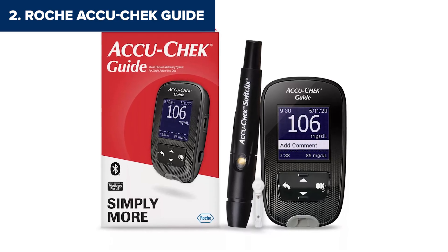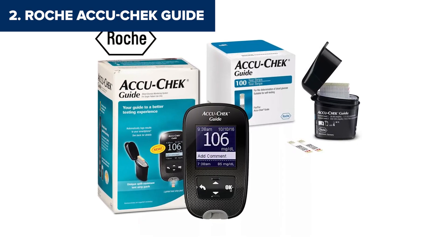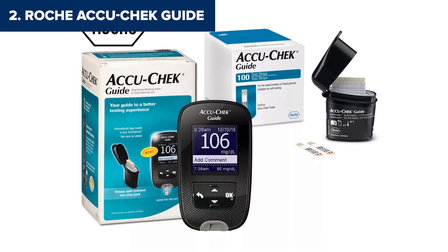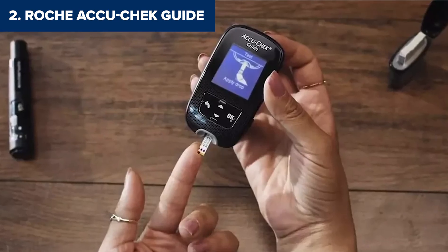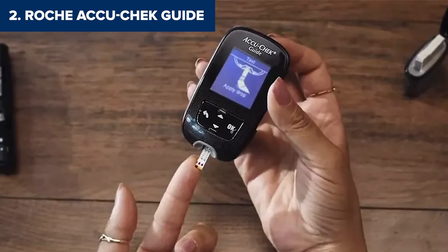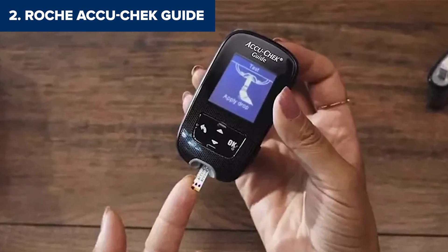Of course, there are a couple of downsides. At 0.6 microliters, the blood sample size is a bit larger than some other models, and the test strips can be pricier than average. Some users might also find the device slightly bulkier than other compact options. But if convenience and usability are at the top of your list, the AccuCheck Guide is a strong contender — a great pick for anyone who wants modern features combined with ease of use. Still, there's one product that edges it out, so let's see who takes the top spot.